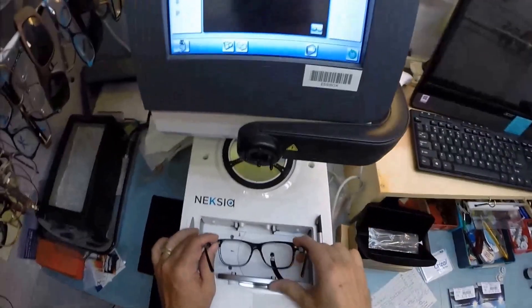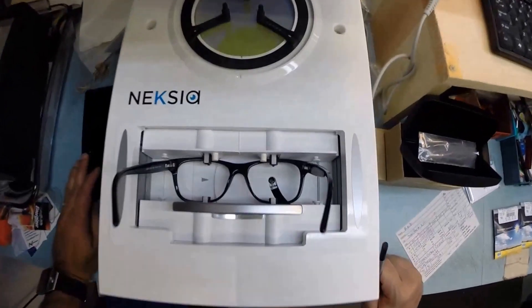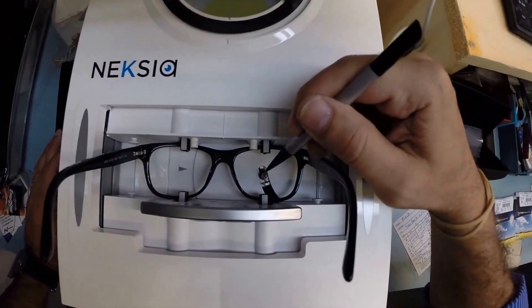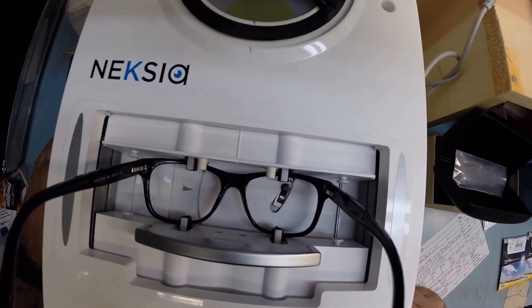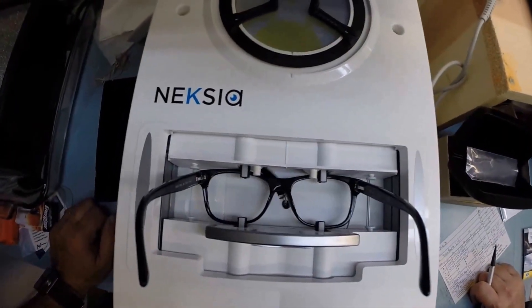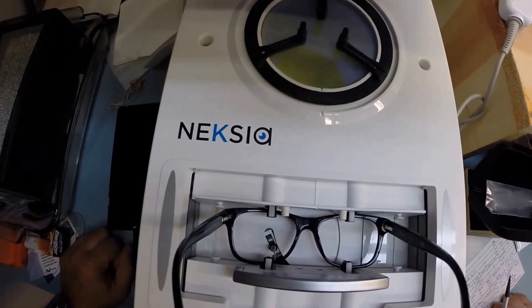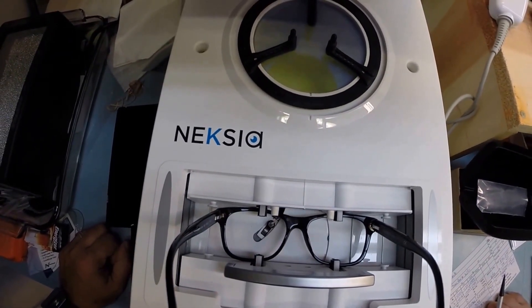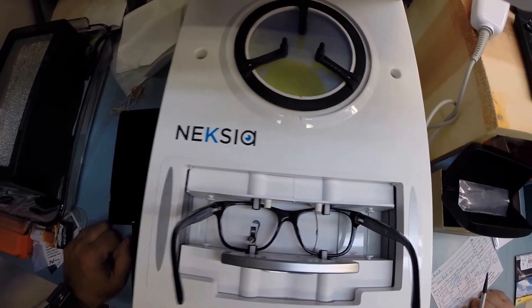I'm going to take your frame, put it into the tracing element of my edger, and hit the start button. A little stylus is going to pop up and go around and trace the shape of the right lens before doing the same thing for the left. Here at FreePrescriptionLenses.com, where everyone loves a bargain and no one is disappointed in quality, you buy a genuine authentic Versace frame and you will receive one free pair of clear single vision prescription lenses or non-prescription fashion lenses.